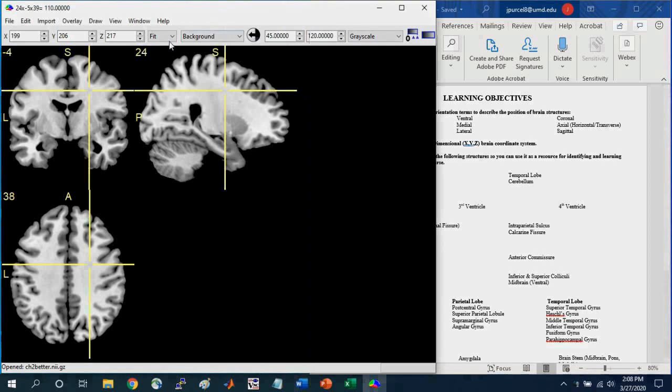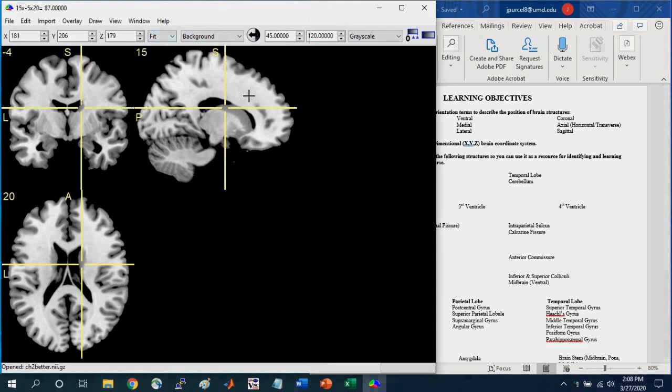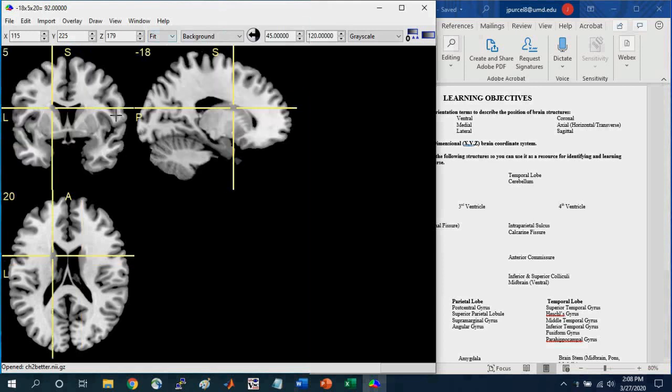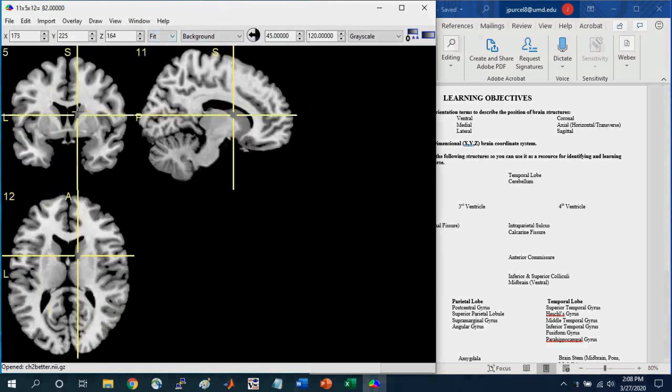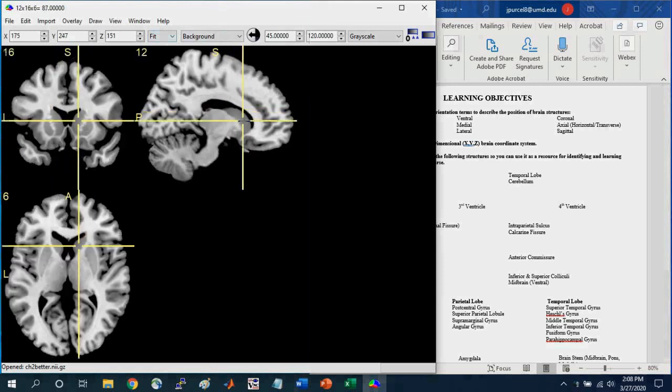Another parameter that you might be interested in is the zoom parameter. And so we can navigate to, say, a smaller brain structure that you might be interested in. So here, just selecting the caudate.